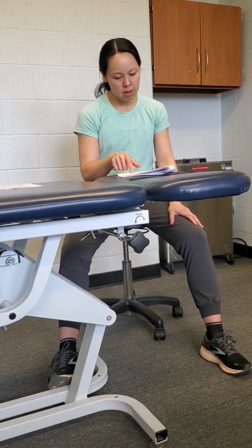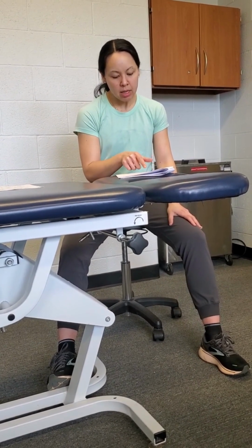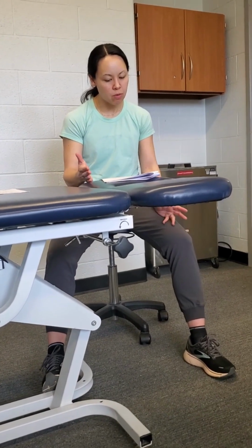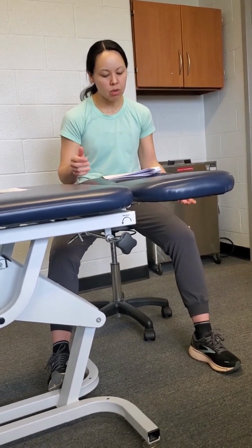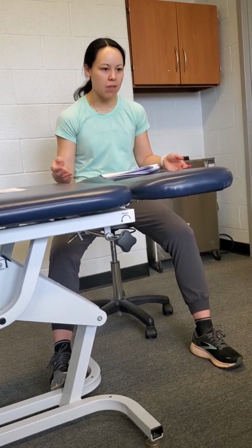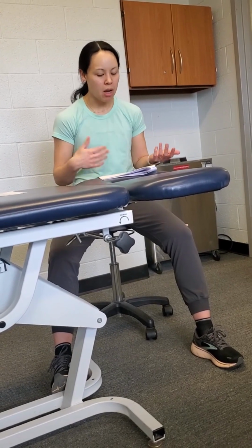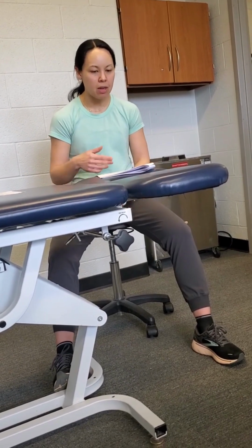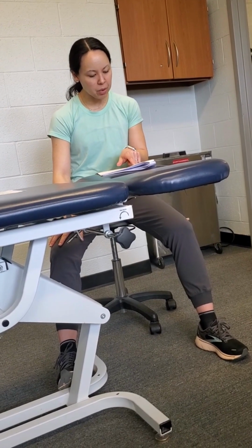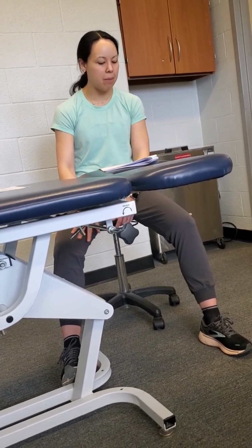Yeah, so the general takeaway if you're doing it passively in the acute phase is let the tourniquet do the work for the first 1 to 2 weeks post-op. They don't have to do anything. If they can tolerate doing some quad sets or ankle pumps or glute sets, they can certainly do that, but just let the tourniquet do the work. And that's what this talks about down here too. It's just the parameters again.